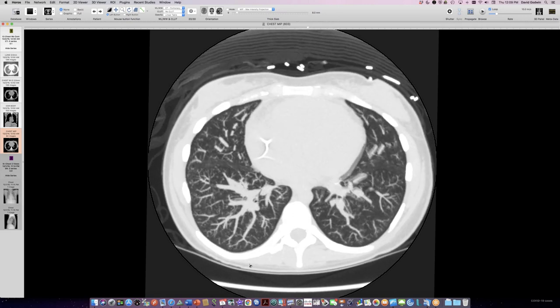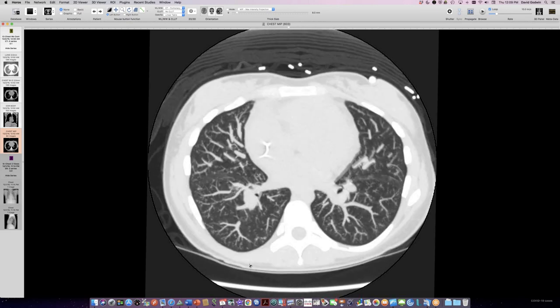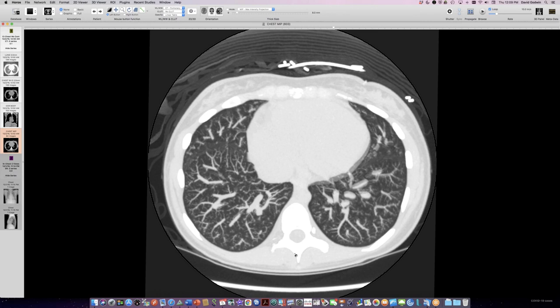When you see ground glass, you have to worry, could this be, was it not Langerhans cell histiocytosis, but pulmonary venous, not a veno-occlusive disease, but that PCH or whatever it's called, pulmonary capillary hemangiomatosis. She doesn't have that much ground glass to strongly suspect that. And it was not that on path. It was just plexiform arteriopathy.